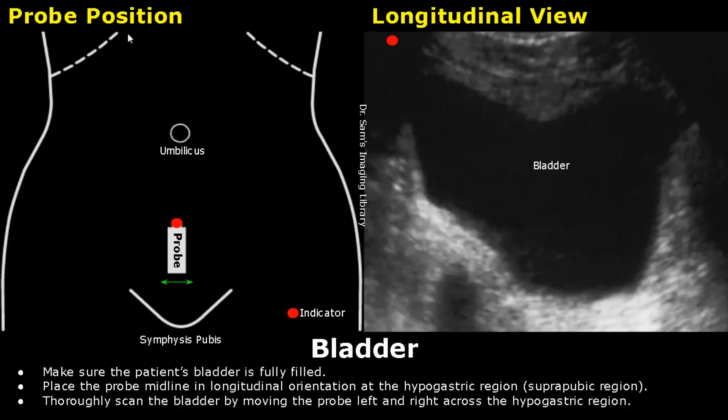These dotted lines are the right and left costal margins, and this is the umbilicus. This white box is the ultrasound probe and the red dot is the indicator or the orientation marker.